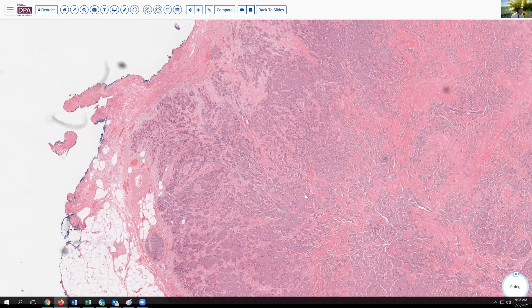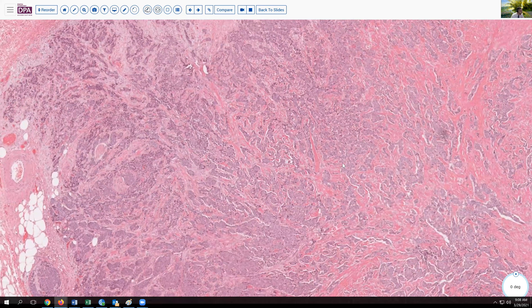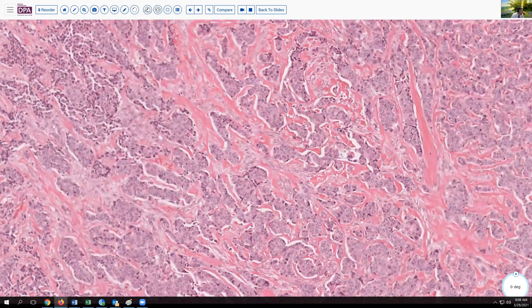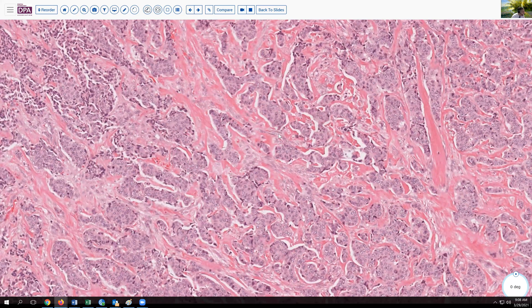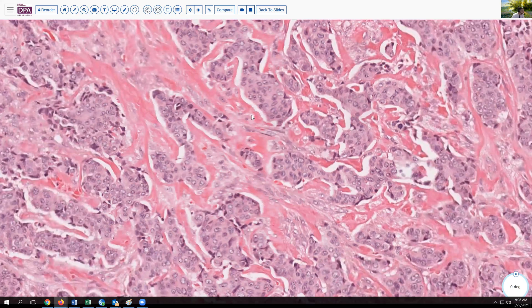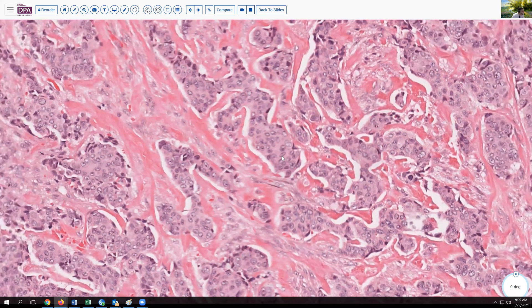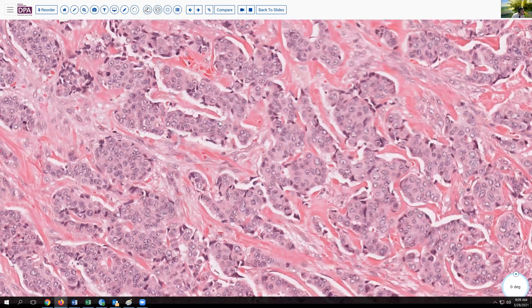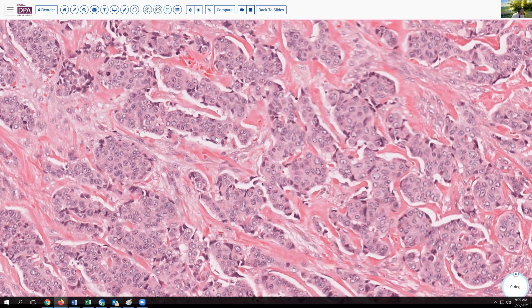On further evaluation, we see that these are nested cells — a little bit like puzzle pieces — with an infiltrative pattern and some desmoplastic stroma intervening. The nests are entirely solid. And as we look at the nuclear features, we see there are several readily recognizable small nucleoli.